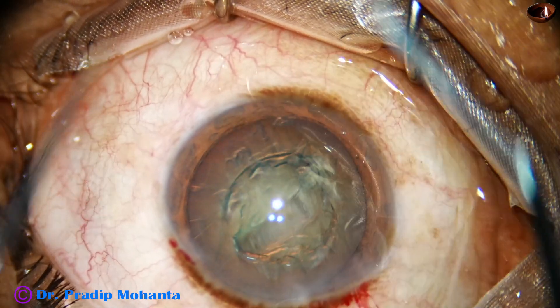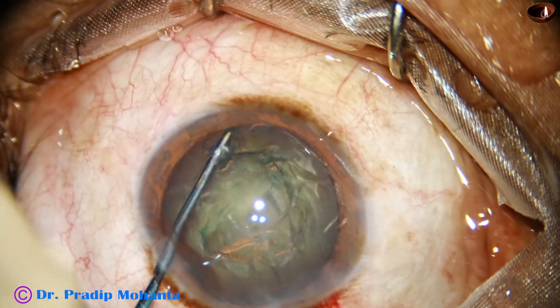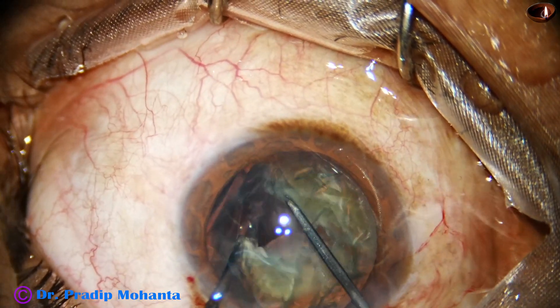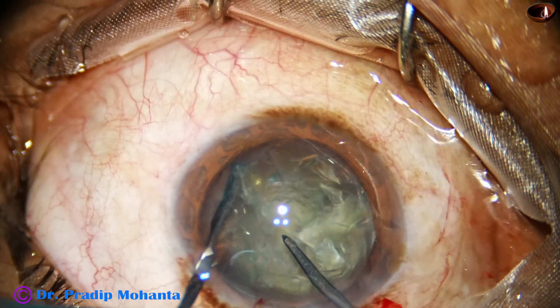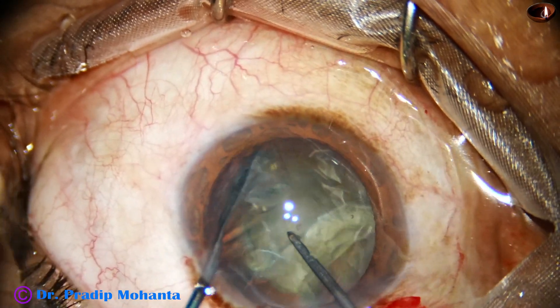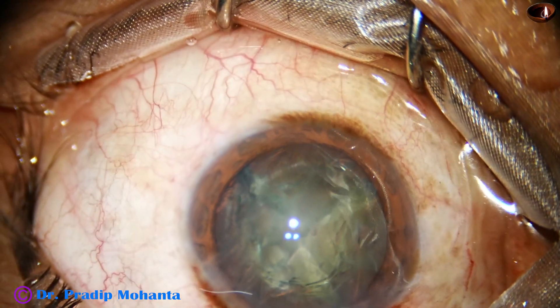So I take the pre-chopper designed by me and the nucleus sustainer. The sustainer hooks the equator, and the pre-chopper goes towards the sustainer. We separate laterally, and I divide the nucleus into three fragments.